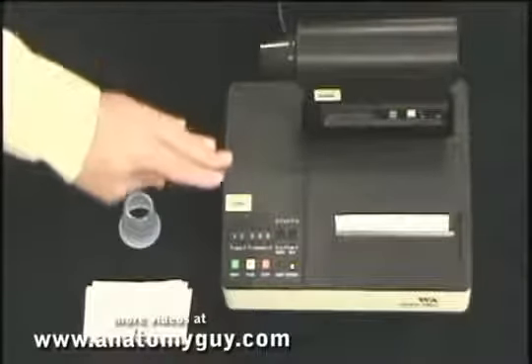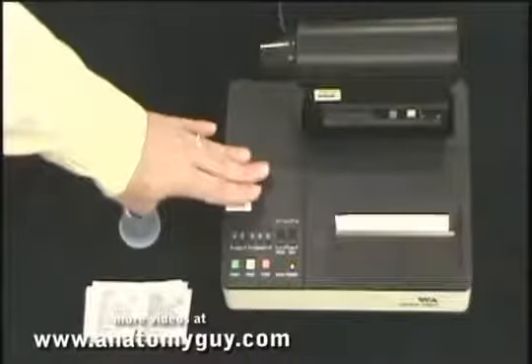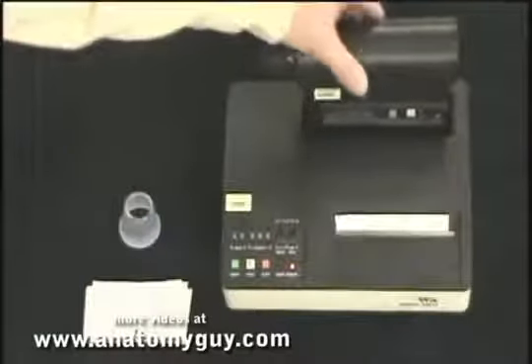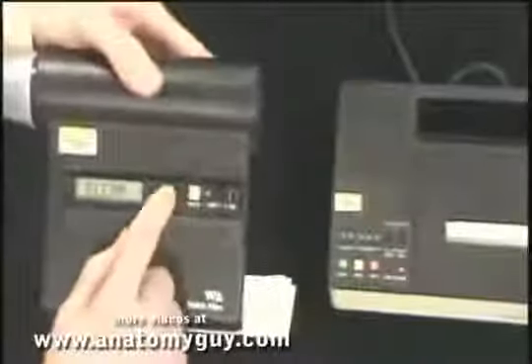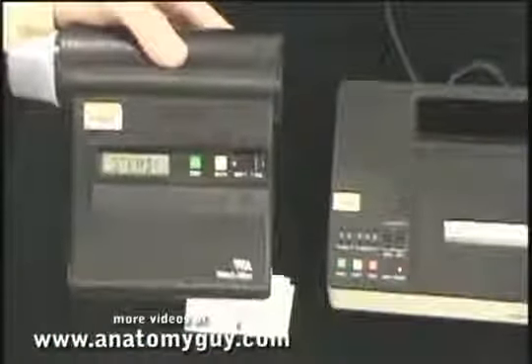The important things are making sure that you have the settings correctly for age, height of the patient, the ethnicity, the gender. And when you take this machine in particular, you want to make sure that you attach the mouthpiece. You obviously need to turn it on, and you set for testing after it says select. And now we're going to do a basic test on forced vital capacity.